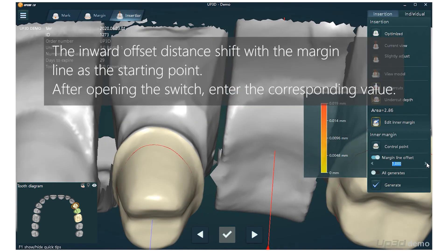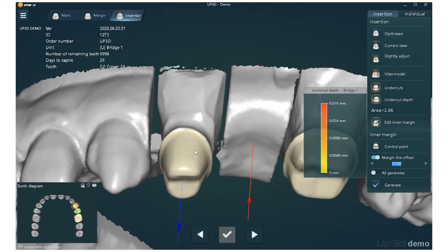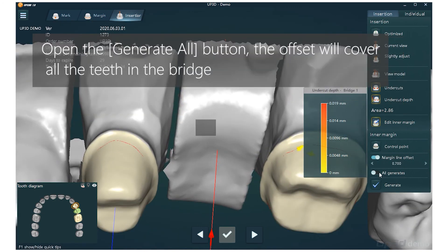The inward offset distance shifts with the margin line at the starting point. After opening the switch, enter the corresponding value. Open the Generate All button and the offset will cover all the teeth in the bridge.